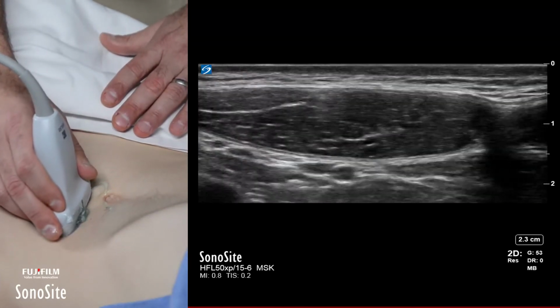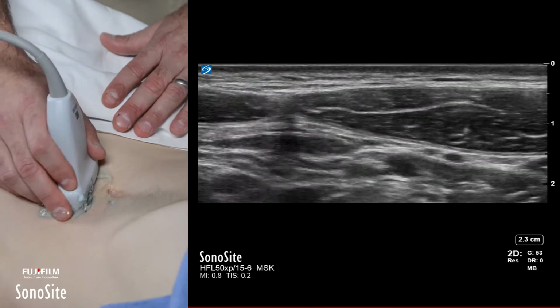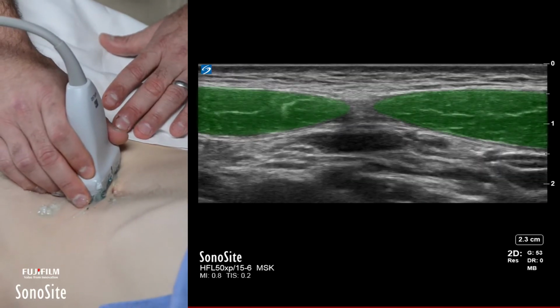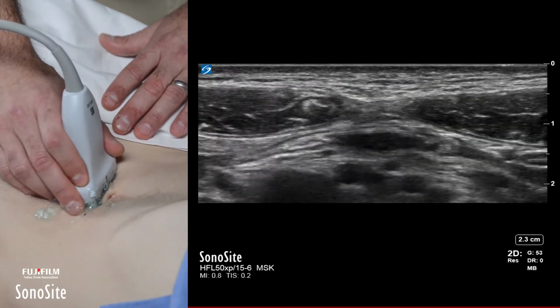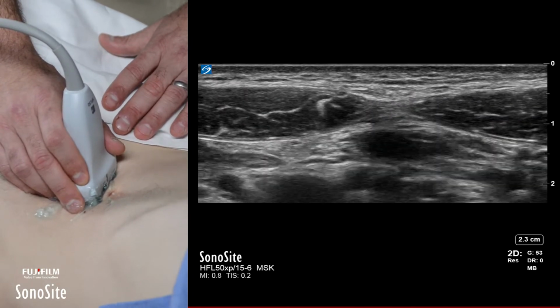So now I am looking at a short axis. So I'm looking at a cross section of the muscle. So you can look at the boundaries of the rectus abdominis. I'm actually looking right at the midline. So I can see the linea alba separating the two rectus abdomini muscles.